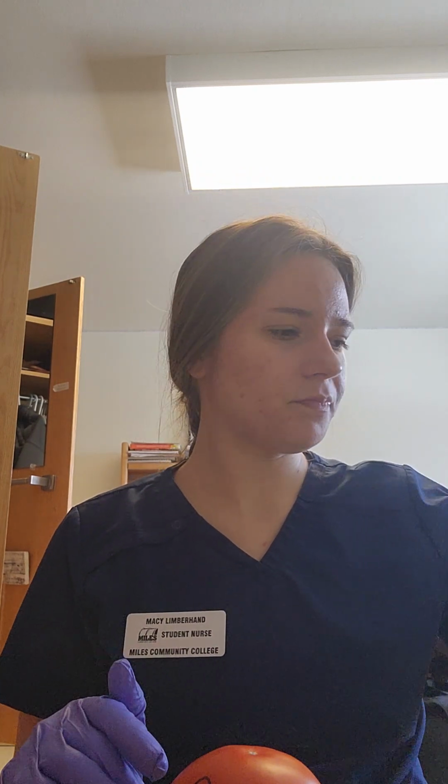So once I have my medication ready, I am going to go to the patient's room. And before I would go in, I would confirm the 6 rights of medication administration again, make sure I have the right drug, the right route, the right dose, it's the right time. And then I would go into my patient's room and I would look at their wristband or have them confirm that this is Skip Rocker, birth date 2/3/75. And that is correct.